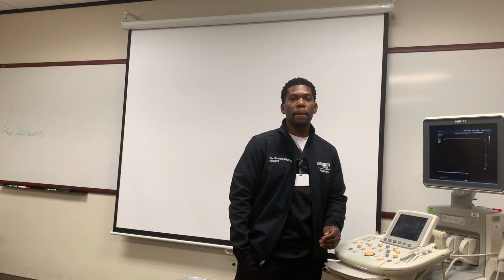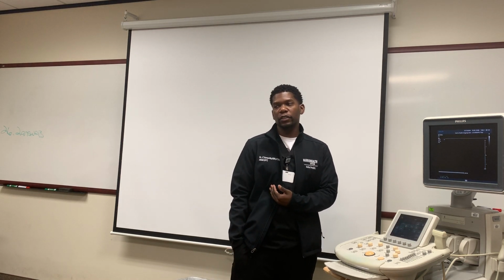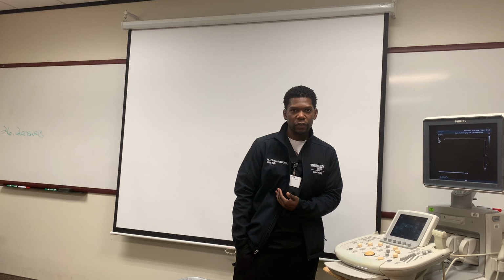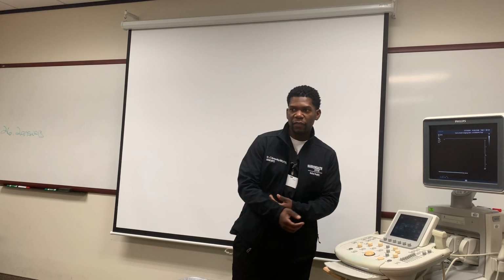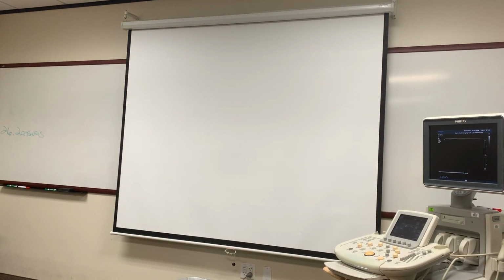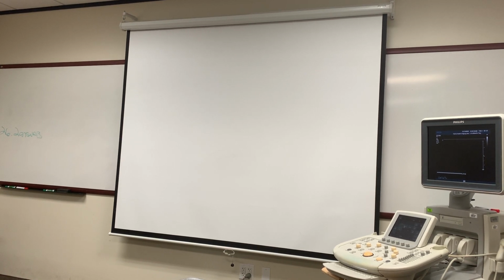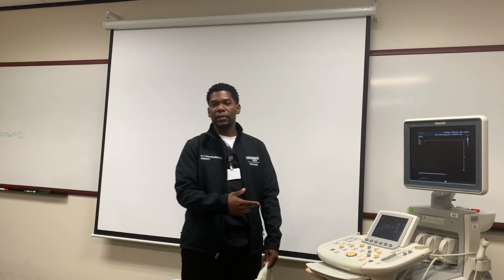So what is it for us to do? Hold that transducer there for a little while to acquire the image? That's what I do, because I want a really still image. So I'm going to just hold my transducer where I need it at. Oh, stop breathing for me. And I'm not going to hold it 5 seconds, of course, but I'm going to hold it just so I got some room to come back. Same thing if I'm doing a portable and my machine is on the left side, I may be on this side of the patient because I don't want to be laying across the patient like this. So I may come on this side, look on the screen, get my picture, take my time and walk back. Boom, freeze that. And then go back and find the image I wanted.